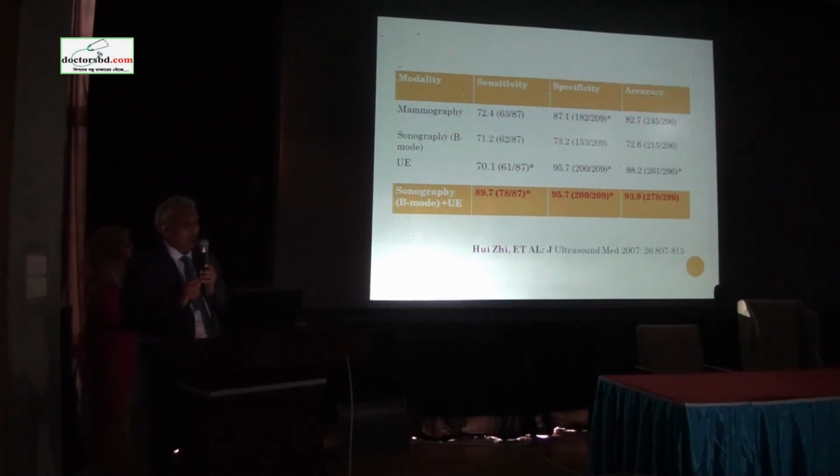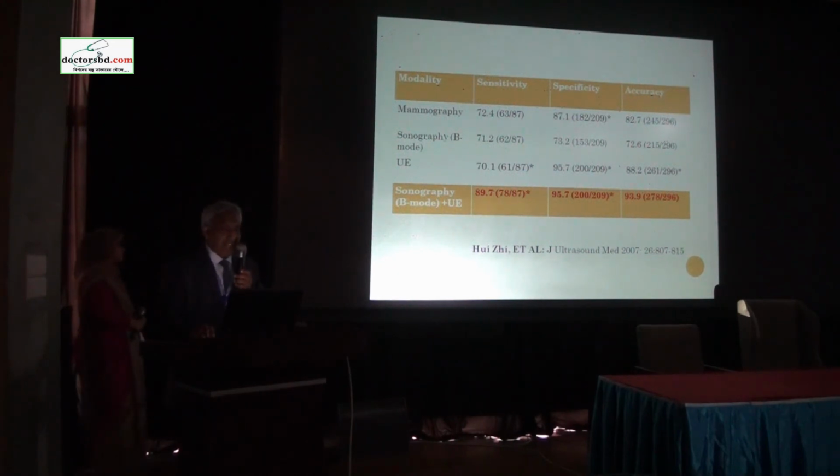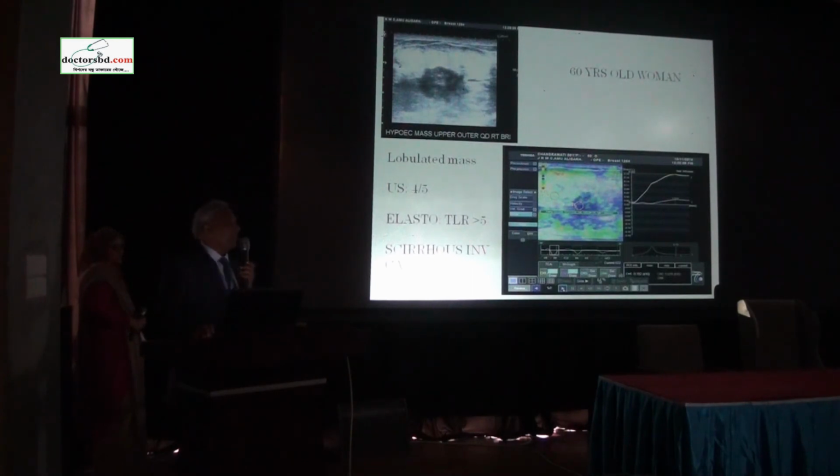And they have come out with the result that if you combine sonography as well as elastography, the accuracy is much higher compared to the mammography alone, compared to the sonography alone. So in their study, the accuracy came out to be 93.9%, which is quite high, significantly higher than the mammogram and the sonography alone.